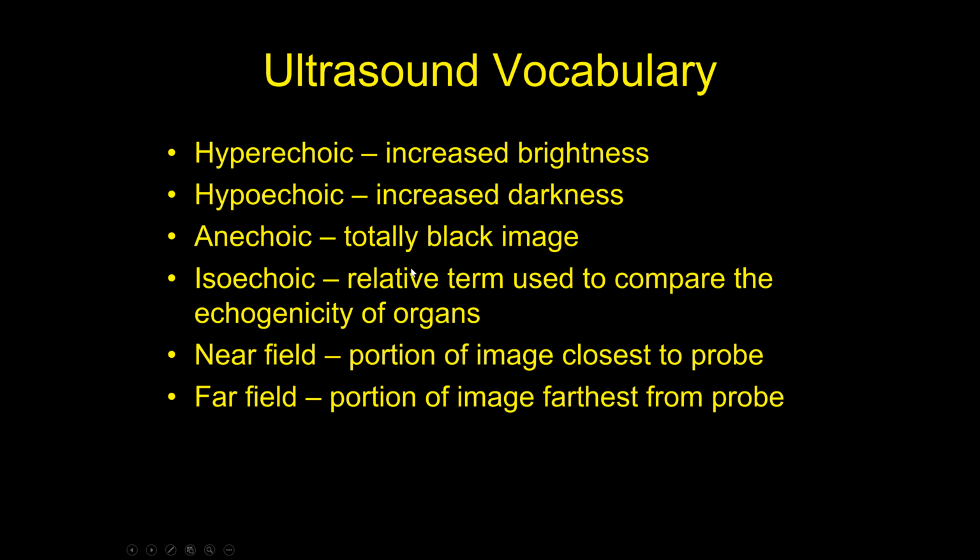We also mentioned this near field and far field concept. The near field is what is closest in the tissues to the probe, and that's where we get our best picture with the best resolution. The far field is everything that's deeper in the tissues, and that's where our picture starts to fall apart. We get poorer quality images because the waveform of energy diverges, dissipates, and is absorbed by the soft tissues in the far field.